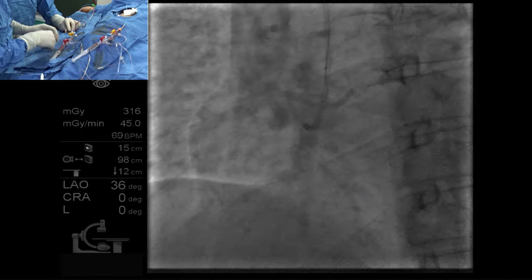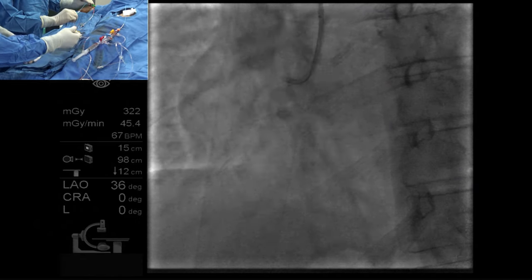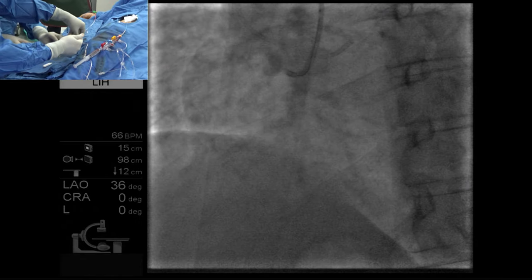Because we are so dependent on the retrograde injection, it may be a good idea to have a guide there, even to protect that left side. You can have a reference guide, then have a Y connector and a wire in properly there to protect the left side. No, because we may not be watching that too often.